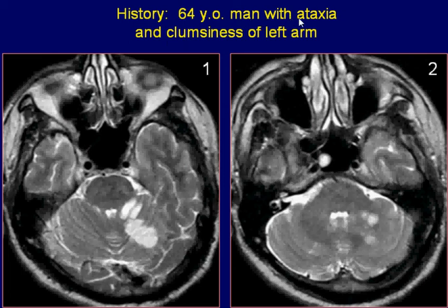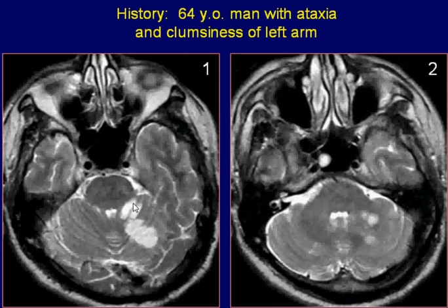A 64-year-old man with ataxia and clumsiness of his left arm. Axial T2-weighted images with cerebellum demonstrate abnormal high-signal areas at the medial aspect of the left cerebellum, involving the left vermis and left superior as well as middle cerebellar peduncles.